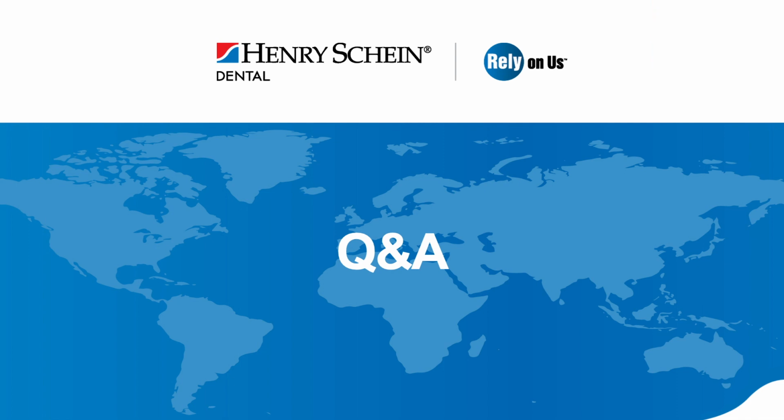All right. I was getting ready to wrap up, and now all these questions are coming in. Perfect. Do you think this workflow is an affordable option for a single dentist practice? Yes, it is. Obviously, I look at it this way. If you buy the printer only for surgical guides and you don't do a lot of implants, is it affordable?